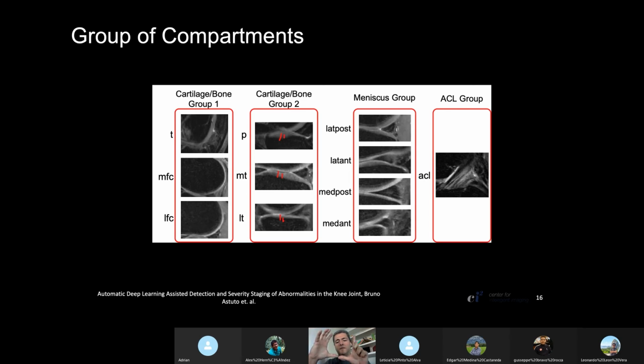So if I rotated too much in the z-axis, I would generate a lot of interpolation on this axis, and I would maybe kill some of the lesions, some of the features, and the lesions are millimetric. Given that the resolution on the z-axis was not that high, I avoided doing rotation in this direction because of that. What else?